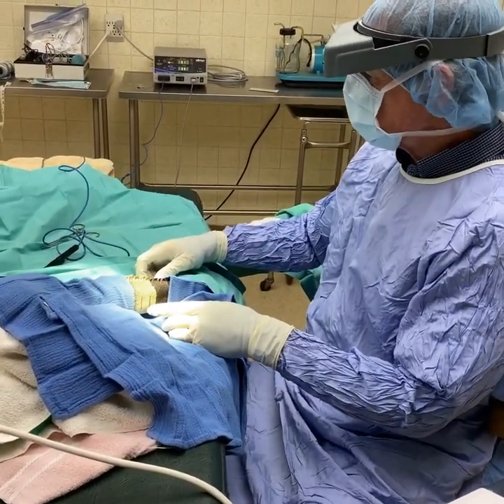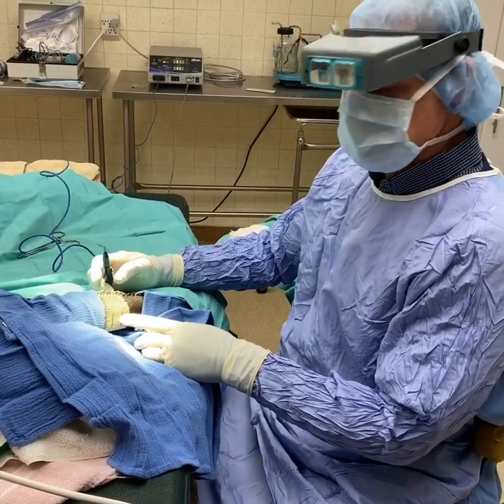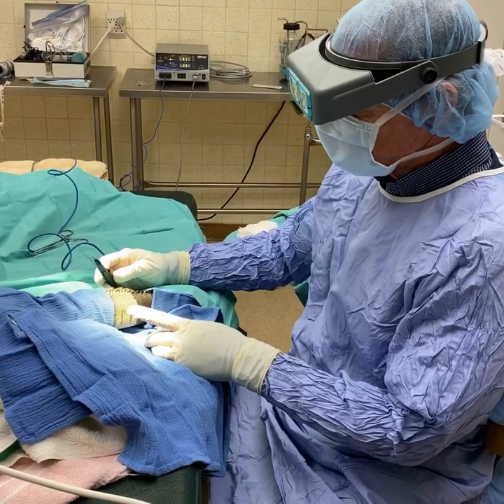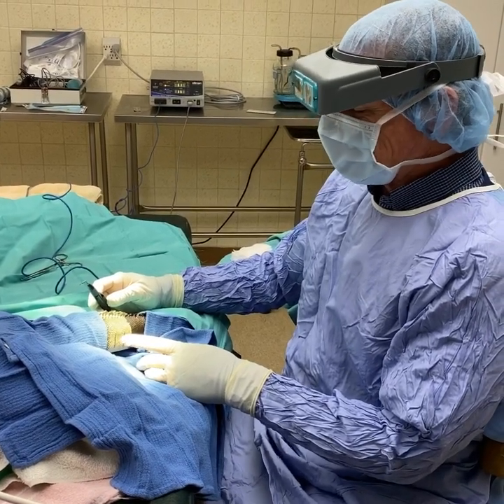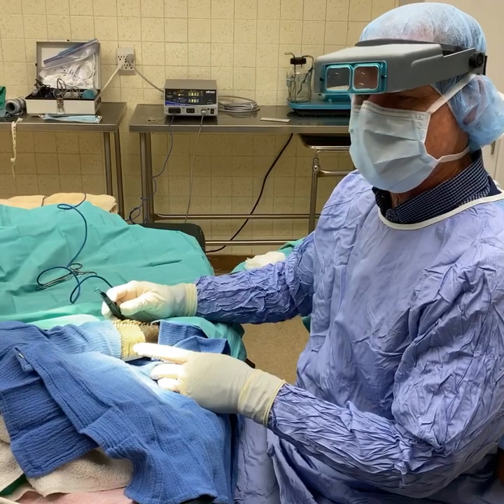Here's our incision site. I don't generally like to make incisions in reptiles with the cautery unit — I use the sharp blade and then use the cautery for hemorrhage control. I feel like they heal faster and better when the incision is made with a scalpel blade.